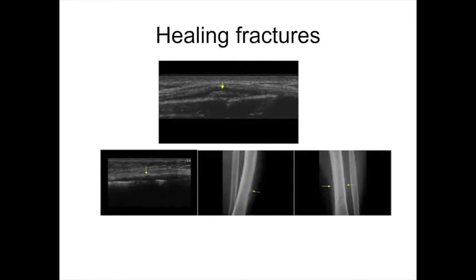Healing fractures are demonstrated on ultrasound. You can see callus formation — subperiosteal callus — here is a fracture line, and you can see callus formation and the healed fracture with periosteal thickening. So ultrasound can be good for following up fractures.